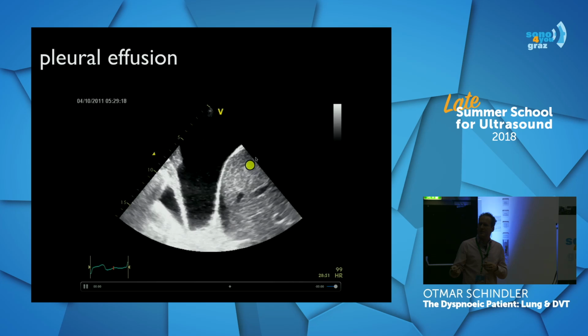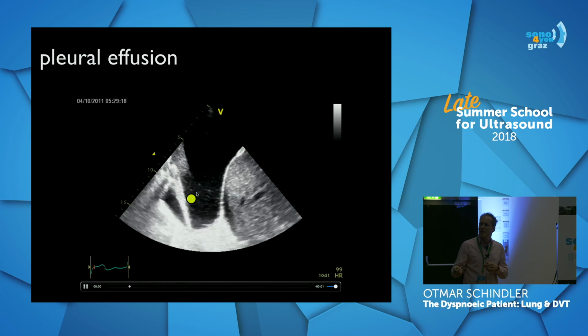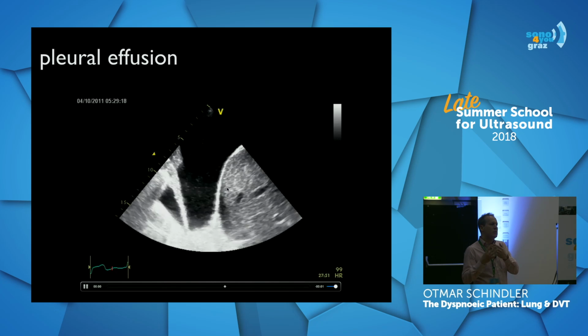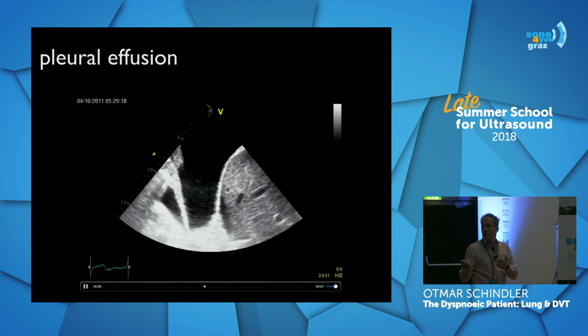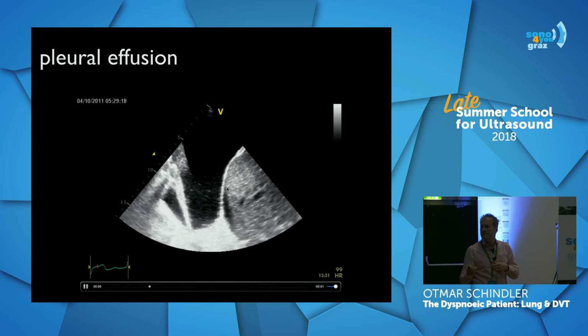In another picture, you have something inside the pleural effusion. It's an adhesion, apparently, and there you also see some granular structure. If the effusion is older, there are some proteins, some fibrin getting inside, so sometimes you see some structures. It could also look like that if it's a fresh hemothorax. So it's getting more and more echogenic with time.